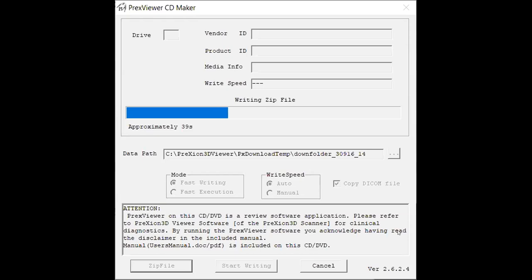And again once you see the completed pop-up that means those files have been copied over and that's about it. Thank you so much for watching.